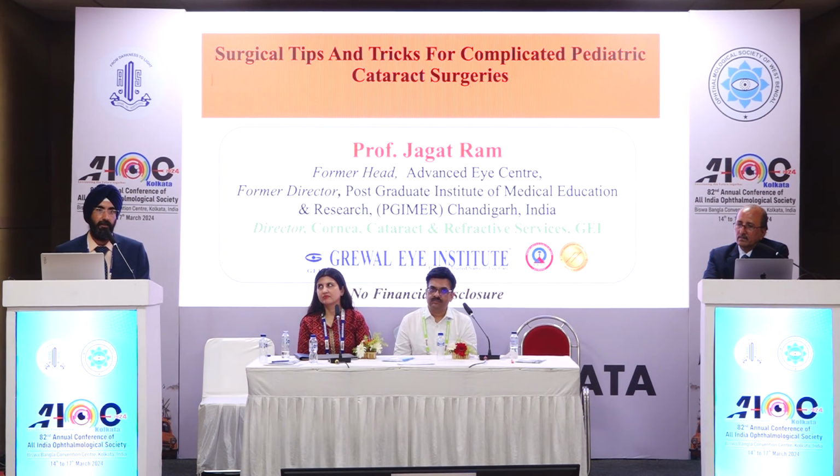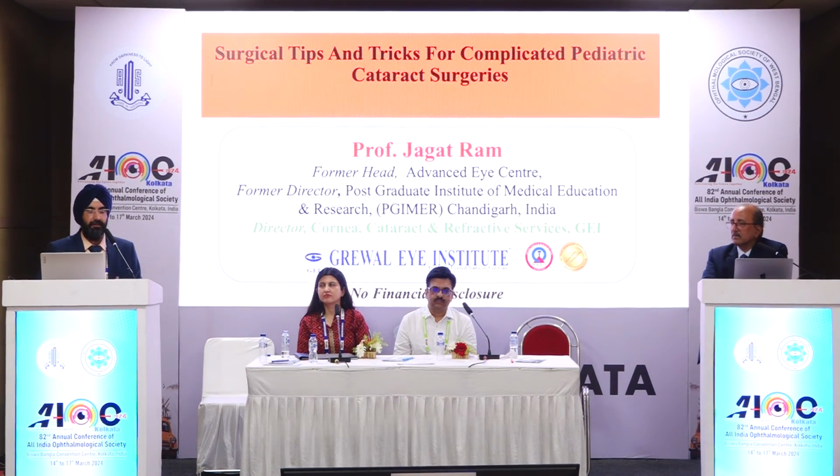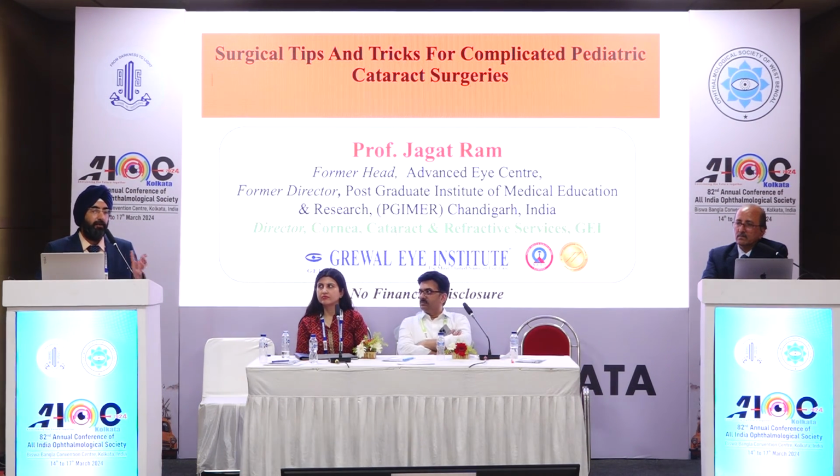Will you stain the posterior capsule before? Not really. We did do a study, but it's not really required with such a good glow. After you remove the cataract, you have a good glow, and doing a rhexis without the dye is much better, because sometimes it goes through the zonules behind and then the view is obscured. The posterior capsule is definitely more elastic as compared to the anterior capsule, so that helps you when you're implanting the IOL rather than making it brittle and leading to tears.